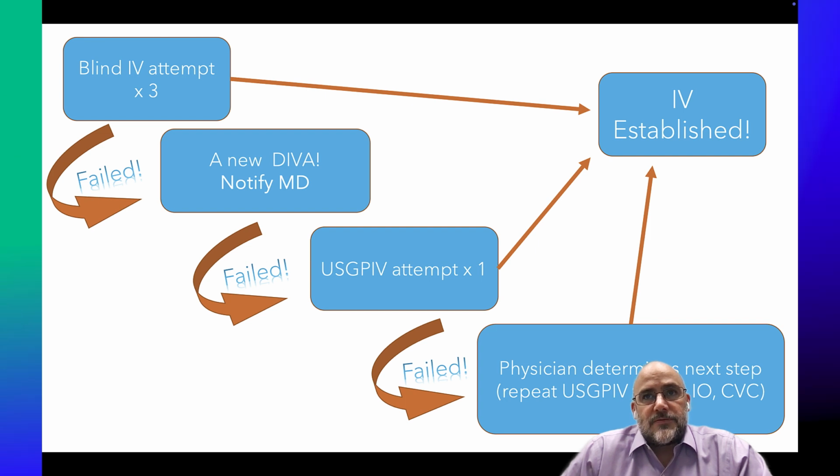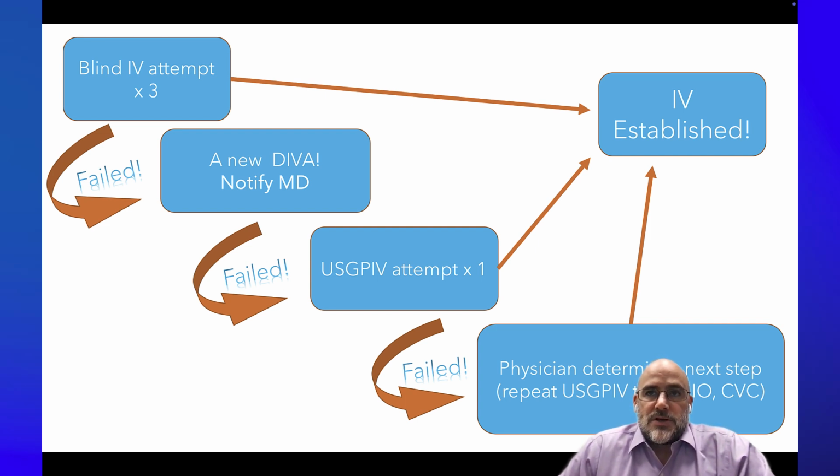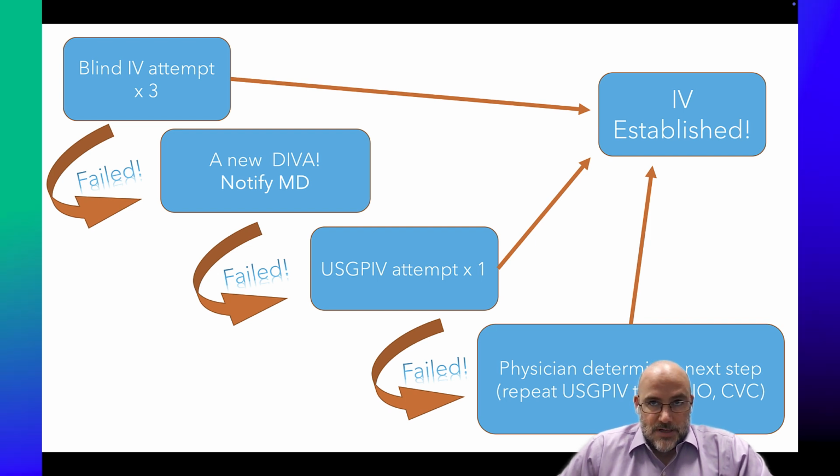And then after that first attempt for this sort of rescue procedure, we need to have a talk, because now we're talking about using and potentially blowing some of these deeper vessels. So the idea at that point, I would recommend reconsidering whether or not an IV is totally necessary, whether the physician or someone else needs to put in an EJ, whether or not a central line actually is in the patient's best interest, before trying to decide and go ahead and do another ultrasound-guided IV at a different spot.